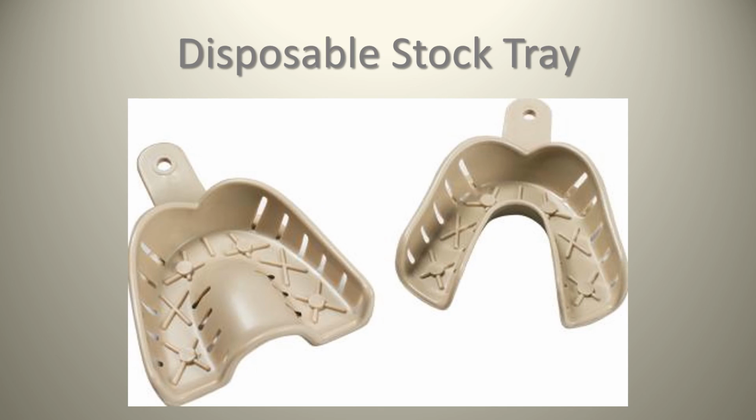But these Teledyne Waterpik trays work really well. The main thing you want to make sure of, when you do have any sort of a stock tray or are using a custom tray, is that you have an adequate amount of adhesive inside of the tray to ensure that whatever impression material you're using stays in place. In our office we use predominantly vinyl polysiloxane or polyvinyl siloxane, VPS, PVS, whatever you want to call it.